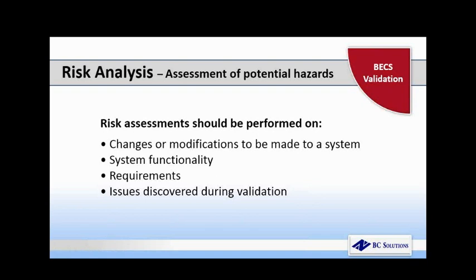Again, this will help you focus your validation on those high-risk items, high-risk functionality, high-risk requirements, those critical control points of the system that you need to verify so that you can perform a validation in a timely fashion. You don't have to take months and months to perform it. You would be able to focus it and make sure that anything that could adversely affect a patient, a donor, or even your business needs is addressed in the validation.